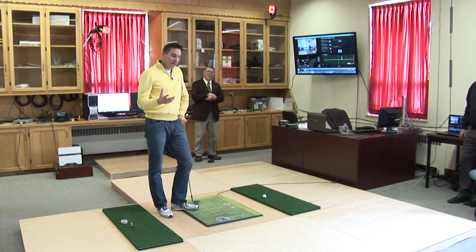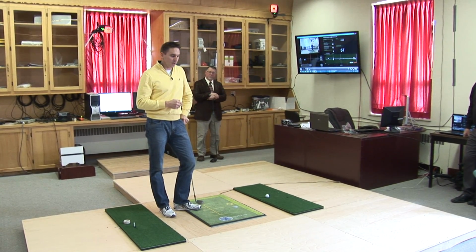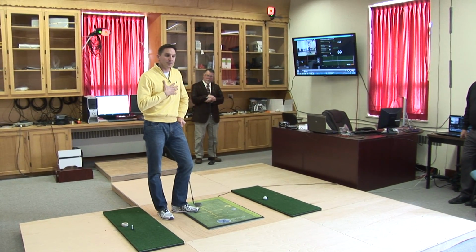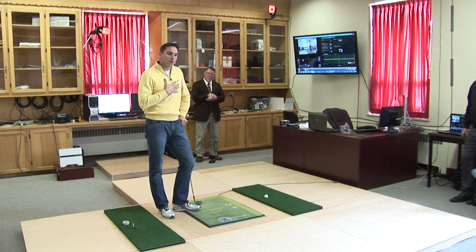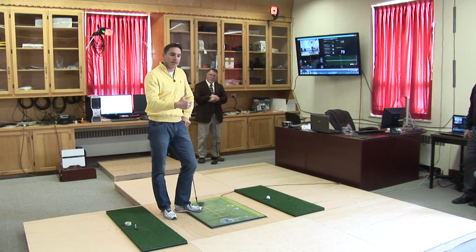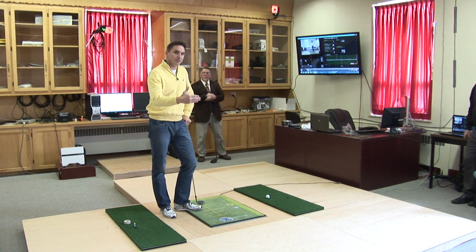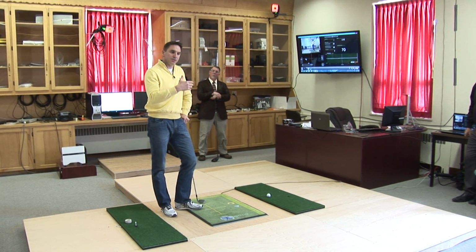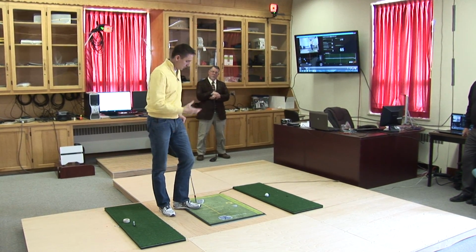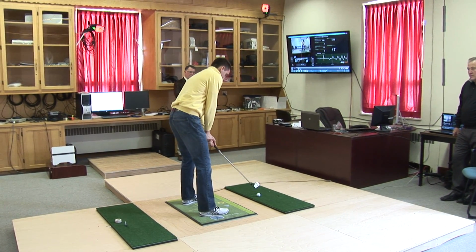Okay, so just to follow up on that last demonstration, which isn't really what you would see someone typically doing in a golf swing on the course, we're going to show you a contrasting scenario. I happen to have a particular type of center of pressure trace where my center of pressure moves towards my back foot during the downswing. Now that doesn't mean that I have some sort of inhibition to get onto my lead side. It's just indicating which foot I'm applying the most vertical force with. So I'm going to go ahead and hit a shot here, and we'll review the trace, and I'll explain what's going on.